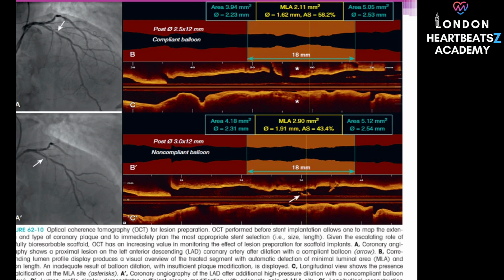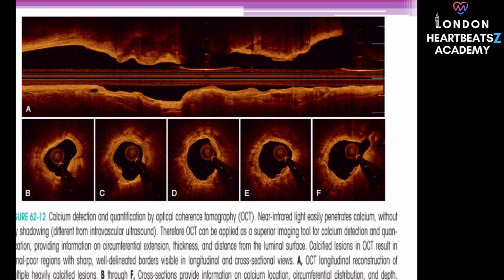Pretty much. The review notes that OCT resolution is needed for reliable TCFA detection, and that TCFA and microchannel images on OCT are strong predictors of disease progression. There are even examples showing plaque changes with statin therapy and an angiographically silent ruptured TCFA clearly seen on OCT. Being able to detect these subtle but critically important features really underscores the power and potential of OCT in understanding and managing coronary artery disease.